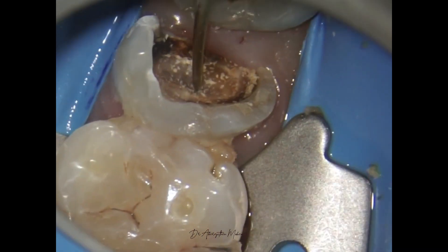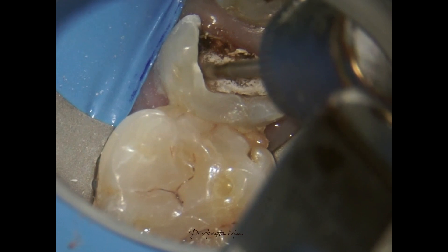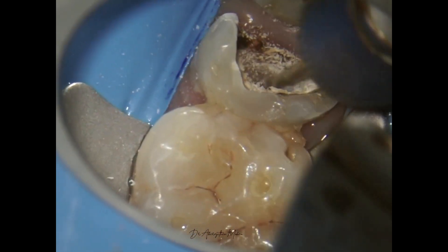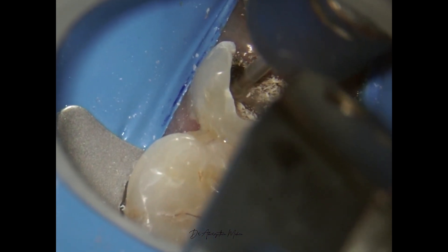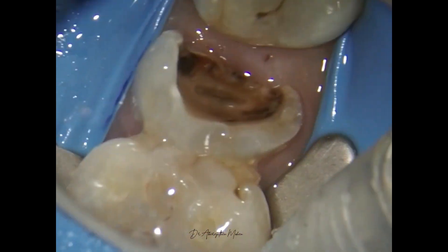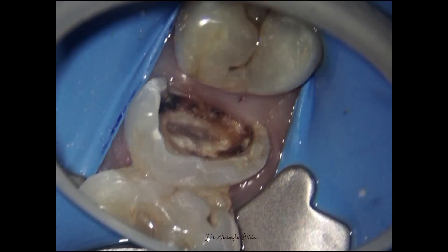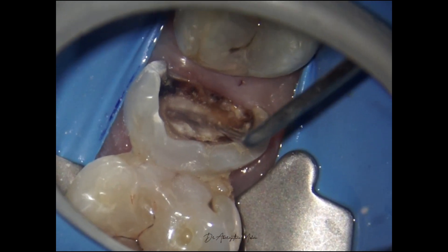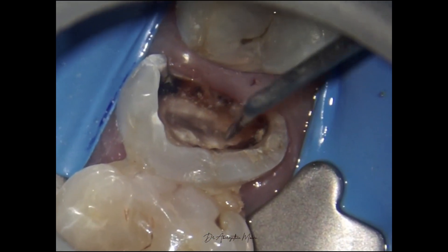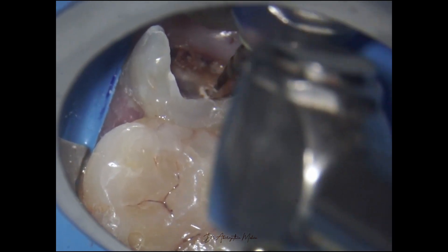Here I'm verifying with my DG-16 to check if my de-roofing is sufficient. After deciding I need a little more removal of the roof and the residual dentinal shelf in the pulp chamber, we go ahead and do that with the same slow speed bur. After cutting, I keep debriding with my scaler to flush away the debris. You can see the pulp chamber is nicely exposed and we are ready to go with our instrumentation sequence. My DG-16 is now able to enter the orifice, following which we proceed to orifice enlargement.